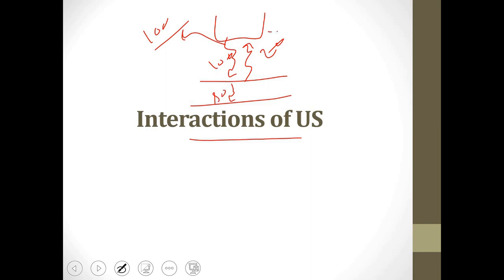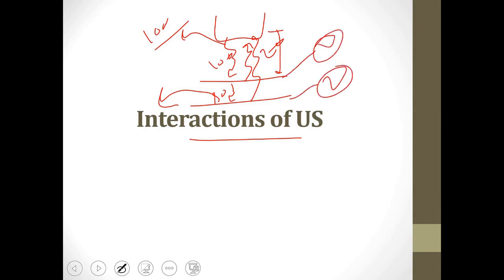But on the way back, it also experiences attenuation. Now the signal coming from the other surface will walk a greater distance, which will cause another attenuation. The original signal here is 80. What comes to the transducer is two signals, one coming from surface 1 and one coming from surface 2. The signal from surface 1 is strong, while the one from surface 2 is weak because it comes from a greater depth.